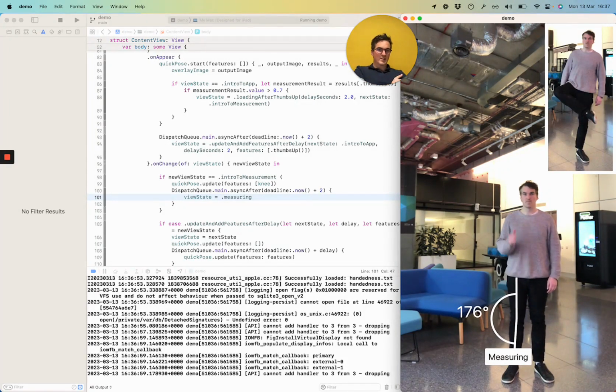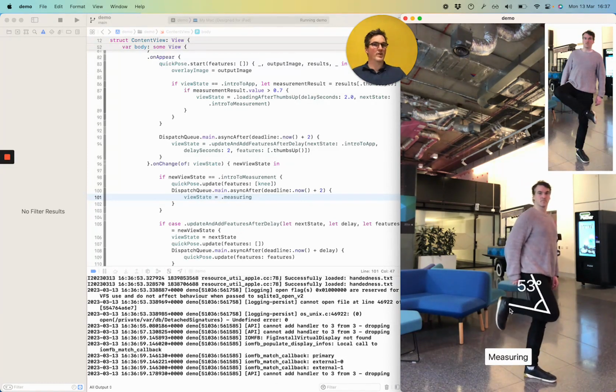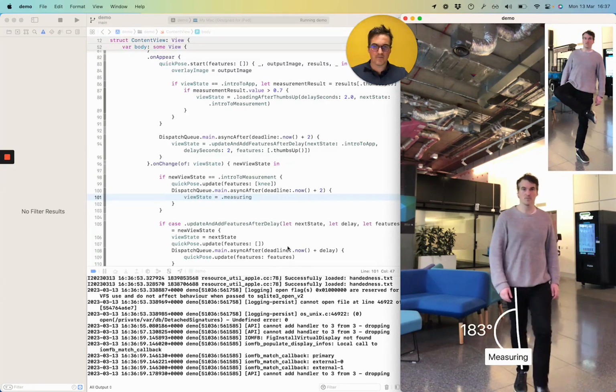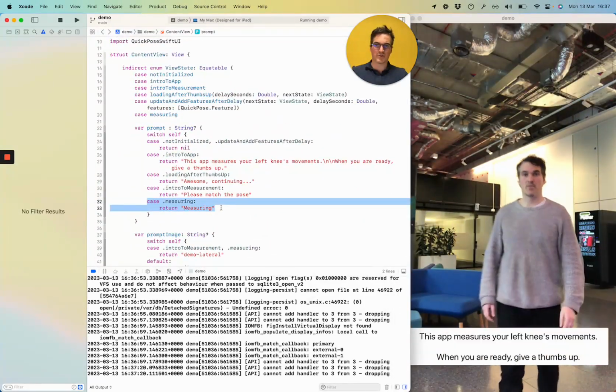Okay, so it was quite slow in capturing the result. What we want is the leg to come up and then the result to be displayed as a fixed result. So let's add a new state and let's call it captured result.